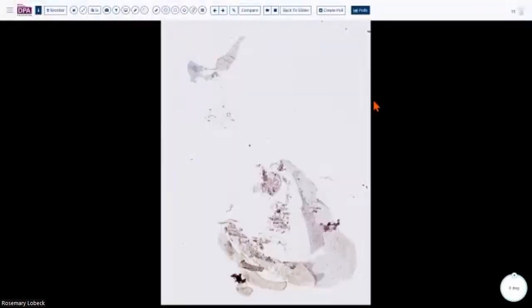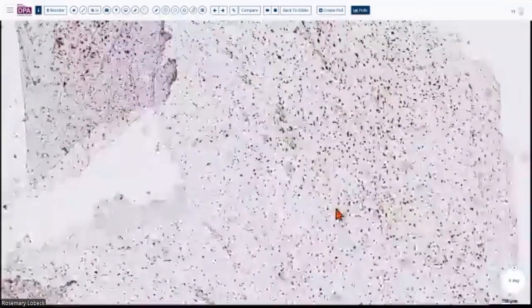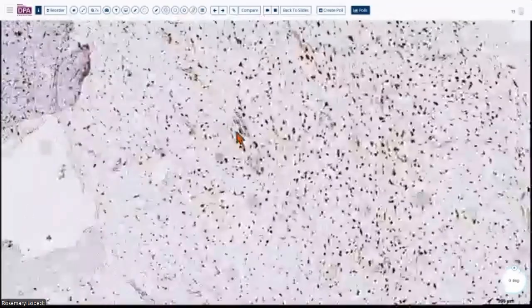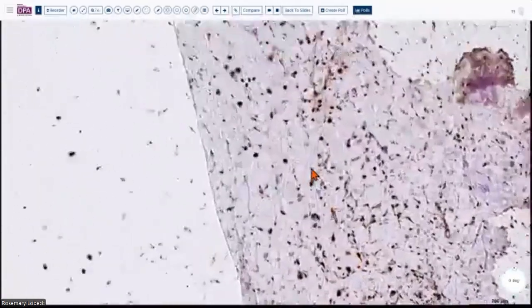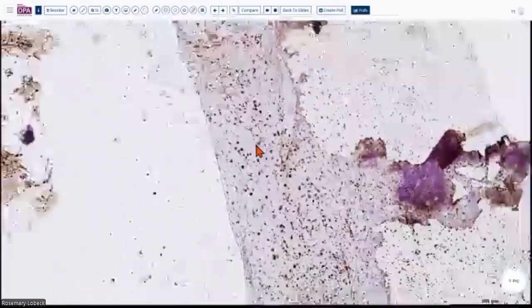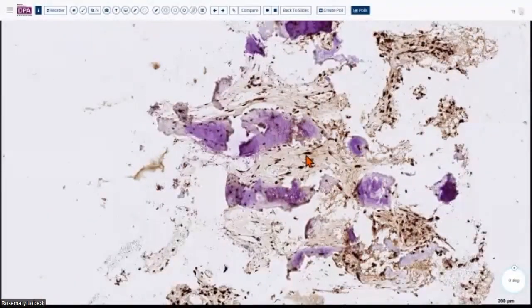So what we did in this case is this stain. This is MDM2, right? On the MDM2, you can clearly see that this is diffuse strong nuclear reactivity in that fibrous stroma surrounding the cartilaginous cap. And not only that, even in the cartilaginous cap, I know it's folded a little bit, but you can still see all the chondrocytic nuclei that are strongly and diffusely positive, right? And not only that, you go in between the bony trabeculae and you see the fibrotic stroma where you can see the nuclei are strongly diffusely positive. So this is a case of parosteal osteosarcoma. It is not an osteochondroma, right?